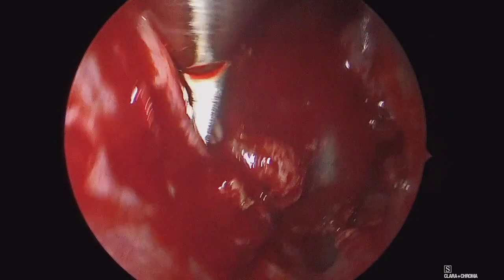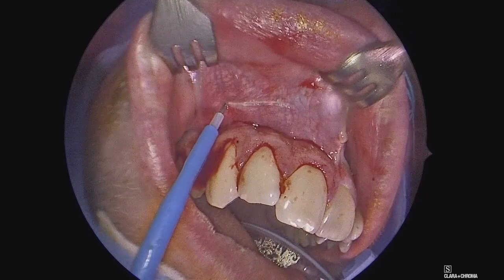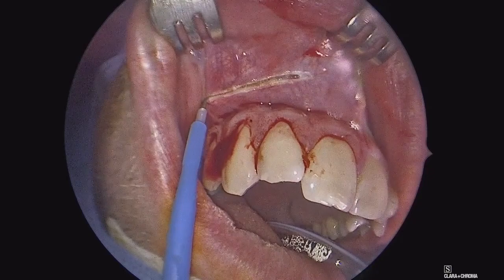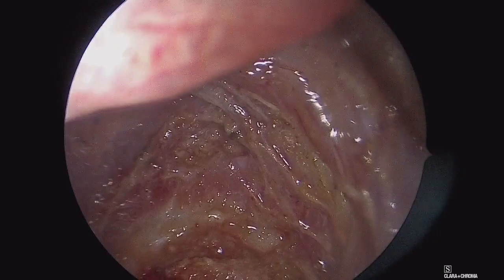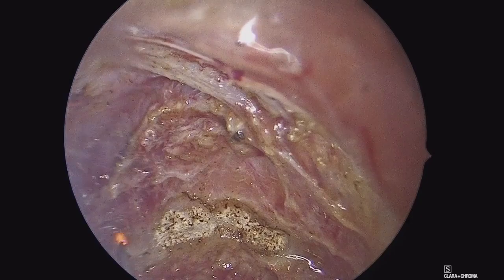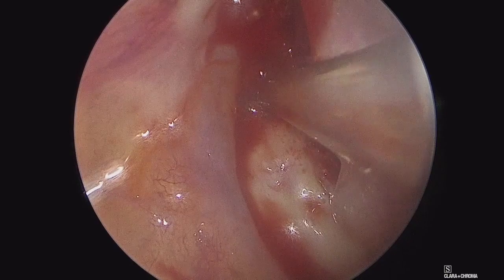Now we're visualizing into the right maxillary sinus and looking posteriorly at the posterior wall towards the pterygopalatine fossa. Due to the extent of the tumor laterally into the infratemporal fossa as well as eroding the middle cranial fossa, we combine this with an ipsilateral transmaxillary or Caldwell-Luc approach. The most important thing when making this initial mucosal incision is to leave enough mucosa on the buccal surface to suture postoperatively. Here we are incising through muscle down to the face of the maxilla, then exposing the periosteum and bone, opening up into the maxillary sinus with a drill above the tooth roots and below the infraorbital nerve, allowing better lateral access to the infratemporal fossa.